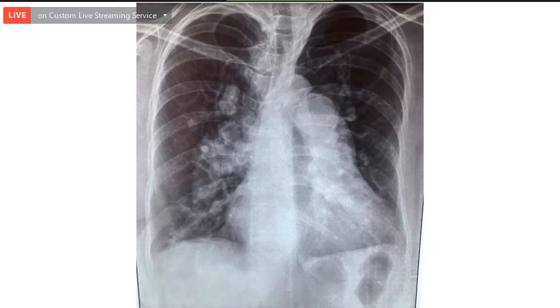Sir, among the borders, sir, calcification, multiple calcifications are seen. Where is the calcification? Sir, hilar region. Whether they are hemosiderosis or calcification, sir, we have to see. Sir, multiple end-on views on both sides. I think when you describe an X-ray chest, after having made a comment about the cardiac enlargement, you should describe the left border of the heart. Okay, sir. Left border of the heart.